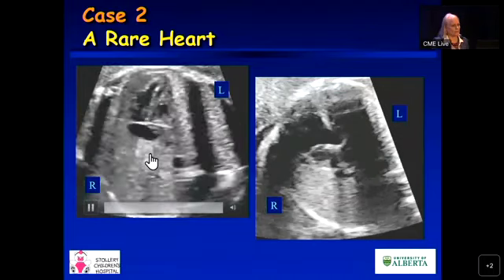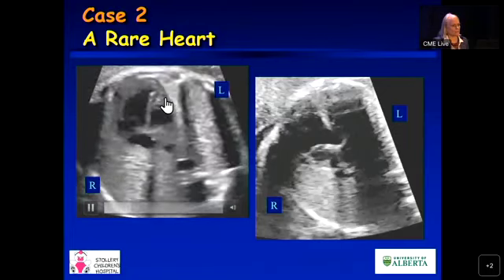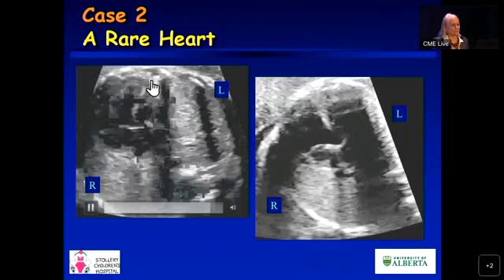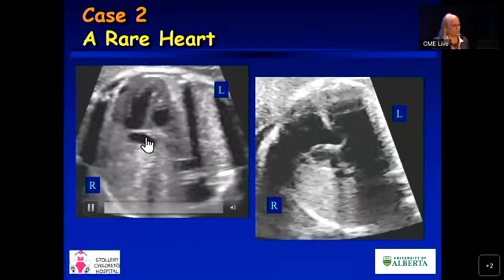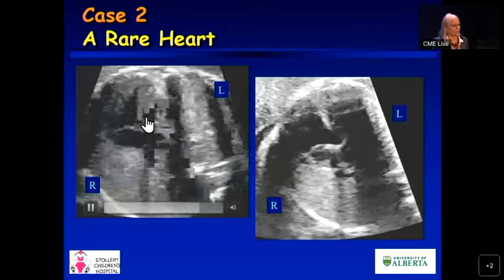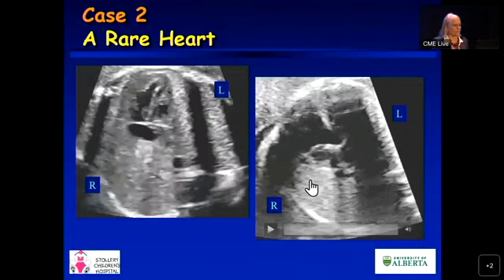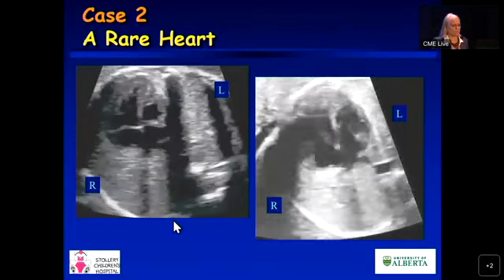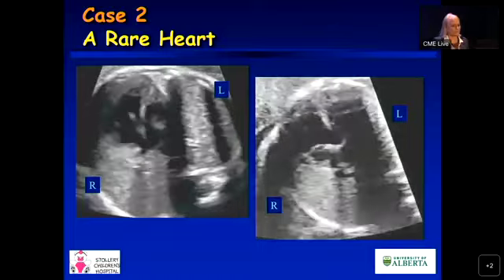Pulmonary veins are here. And definitely this ventricle has a moderator band, right? And they always look kind of foreshortened. They're not so foreshortened. They look even worse in the first trimester, but you can see that offset of the AV valve, and the one that's lower in the septum is actually the tricuspid valve. So for sure, that's the first thing you're thinking. This is CCTGA. But then we swept. Sorry, it's being really jerky. Not me, the image.